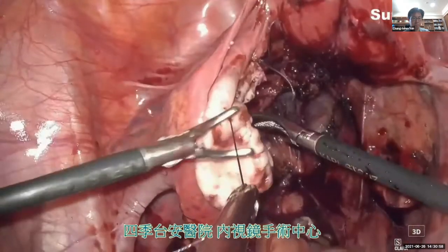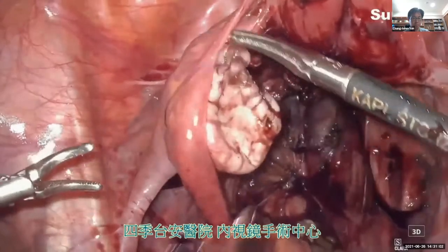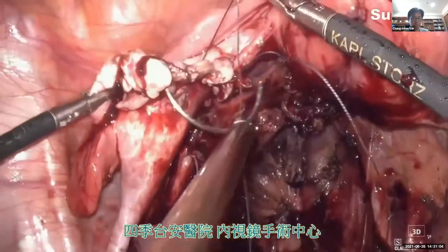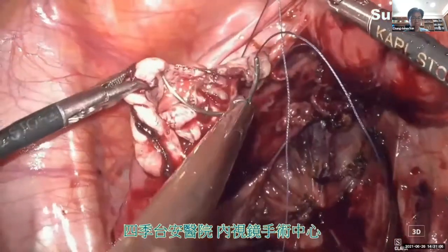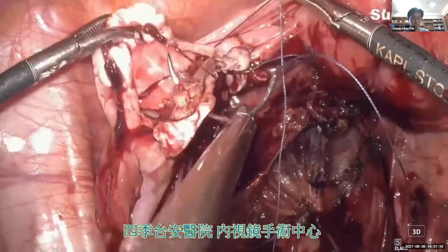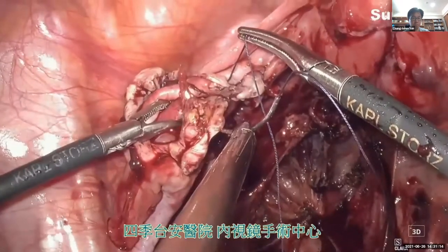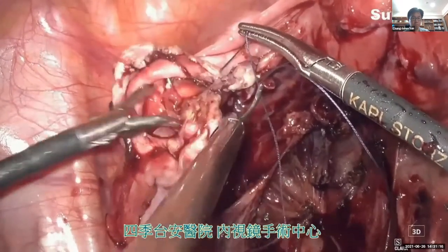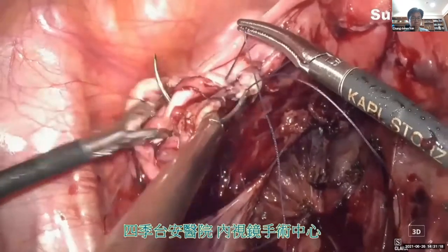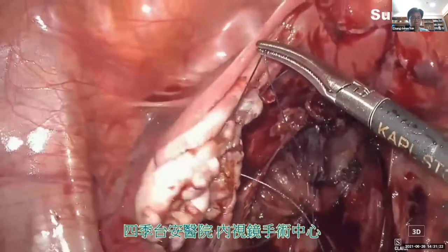Do not pull the string too tight, otherwise we may strangulate the ovary and impair the ovarian blood supply. I incorporate some tissue from the base so we can prevent the hematoma formation.